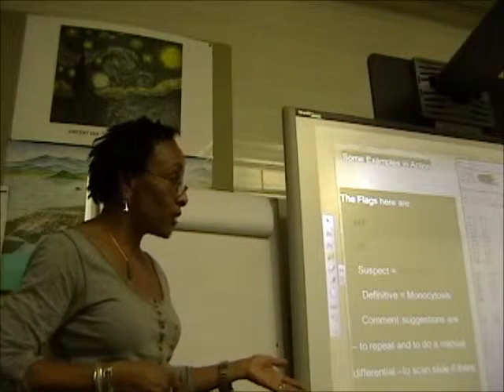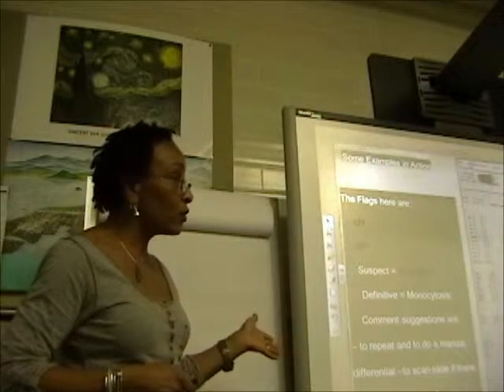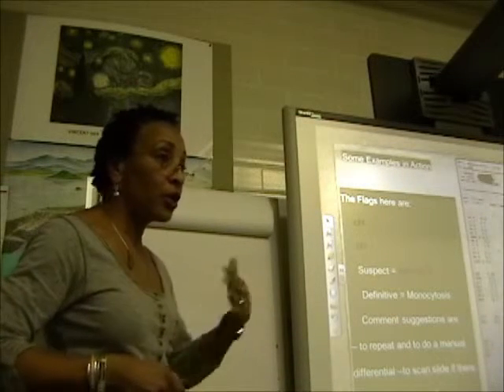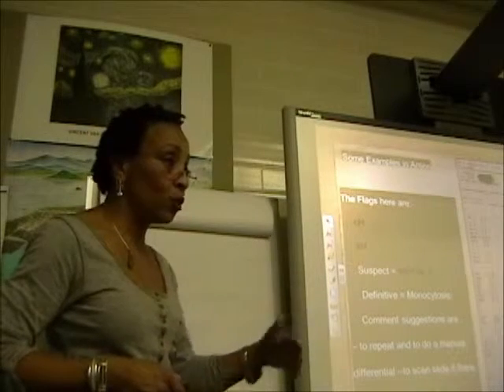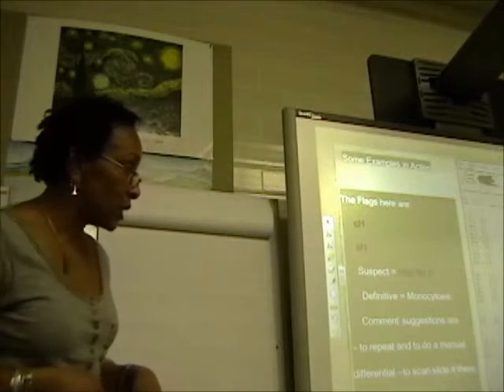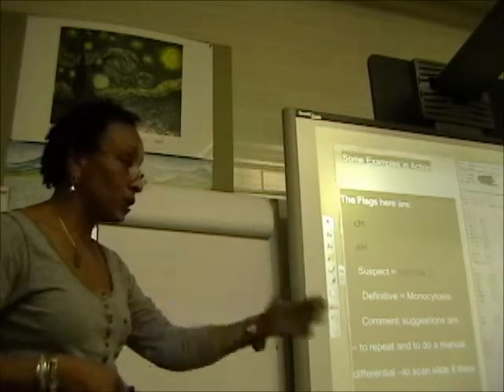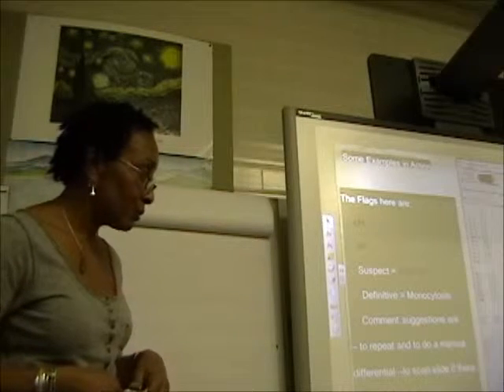And this was one that was actually sent to the pathologist because the white blood cell count was greater than 50,000, and monocytes were greater than 1.5, and so that automatically triggers in the protocol for you to send that to the pathologist so the pathologist can look at it. And after the pathologist did look at it, he said that this patient was suspect for having a CML. So, and he recommended other therapies to go along with this patient.